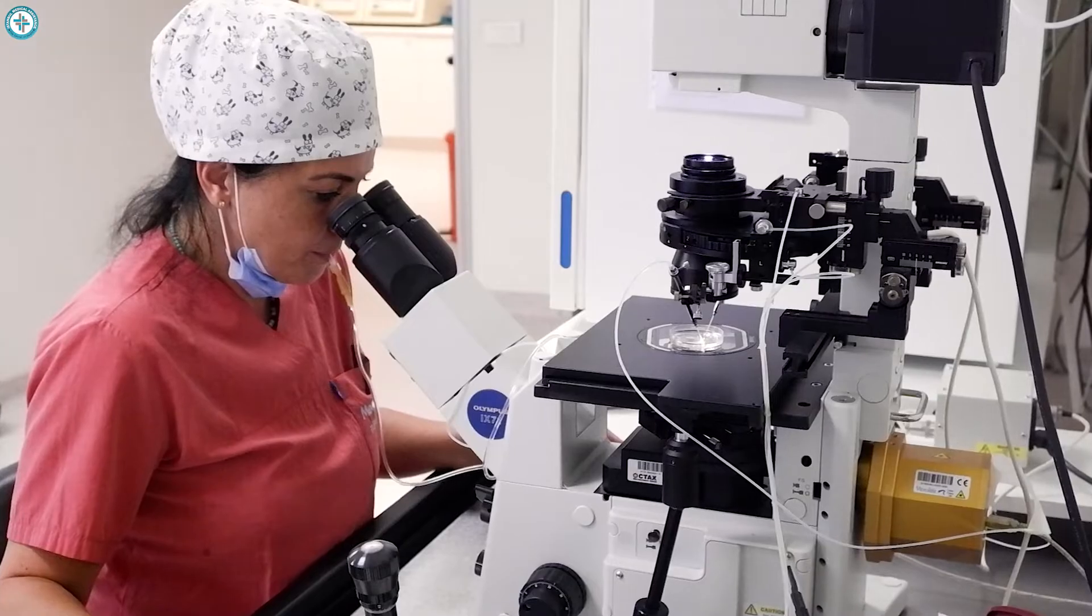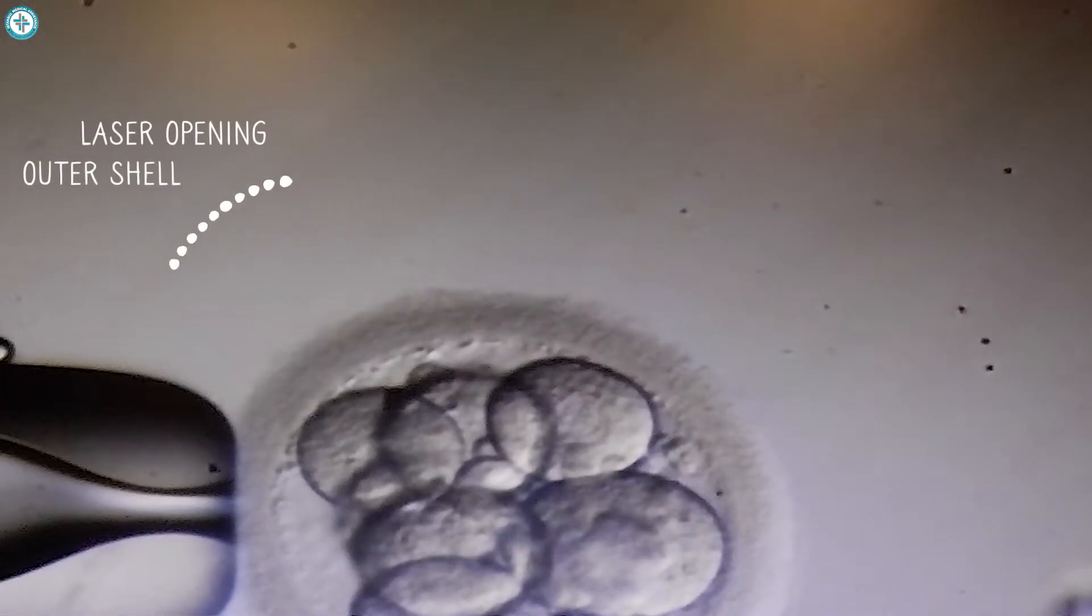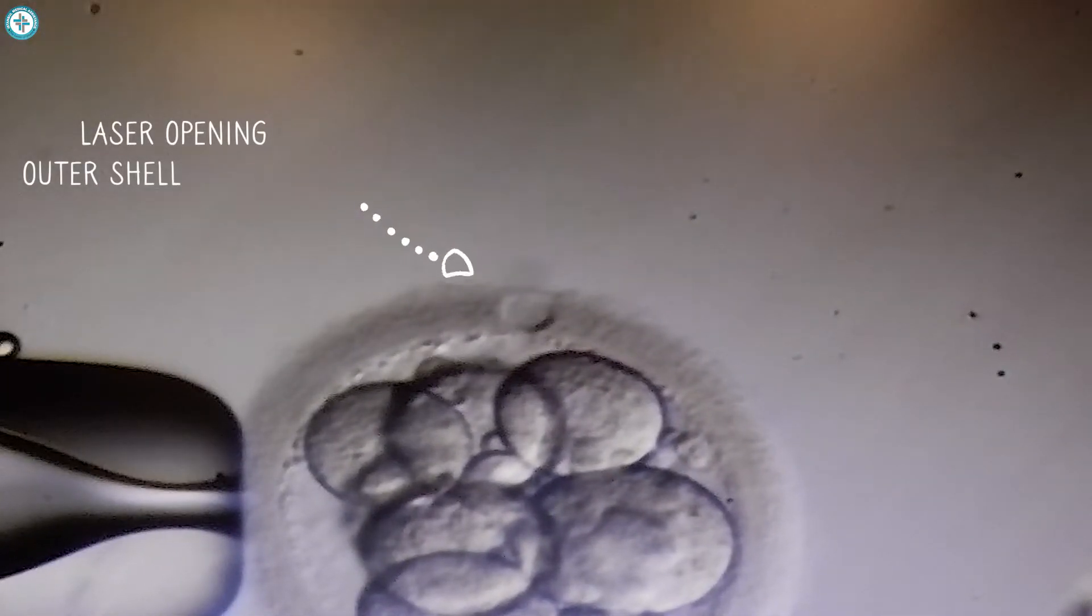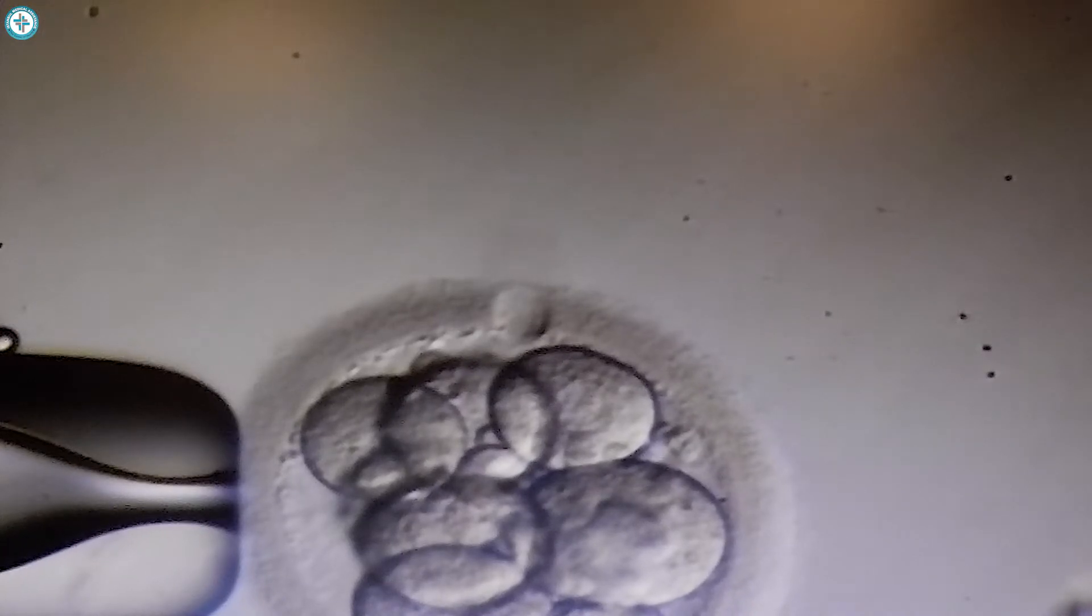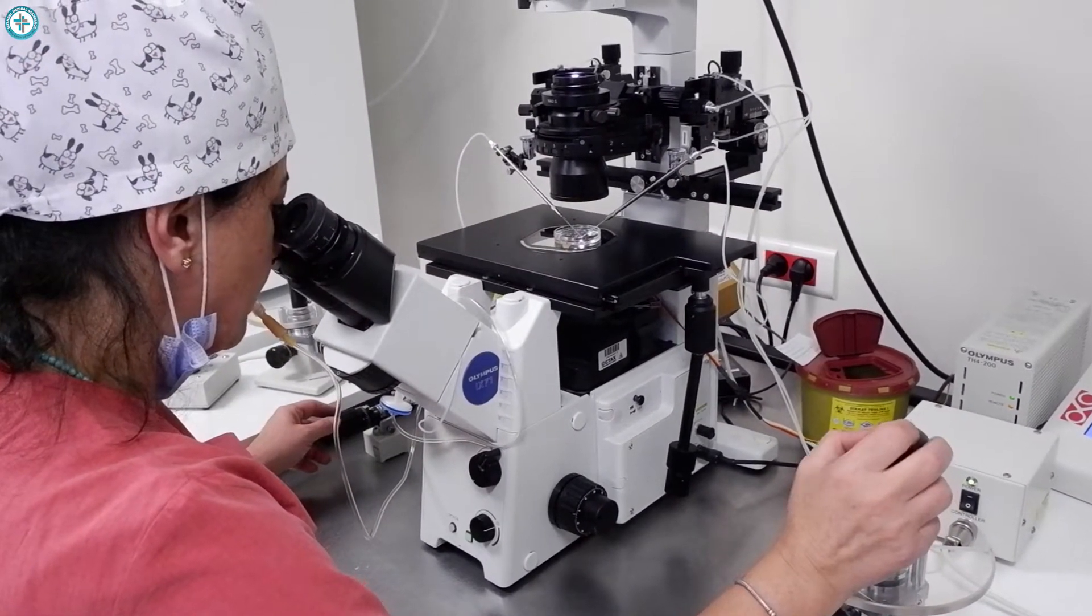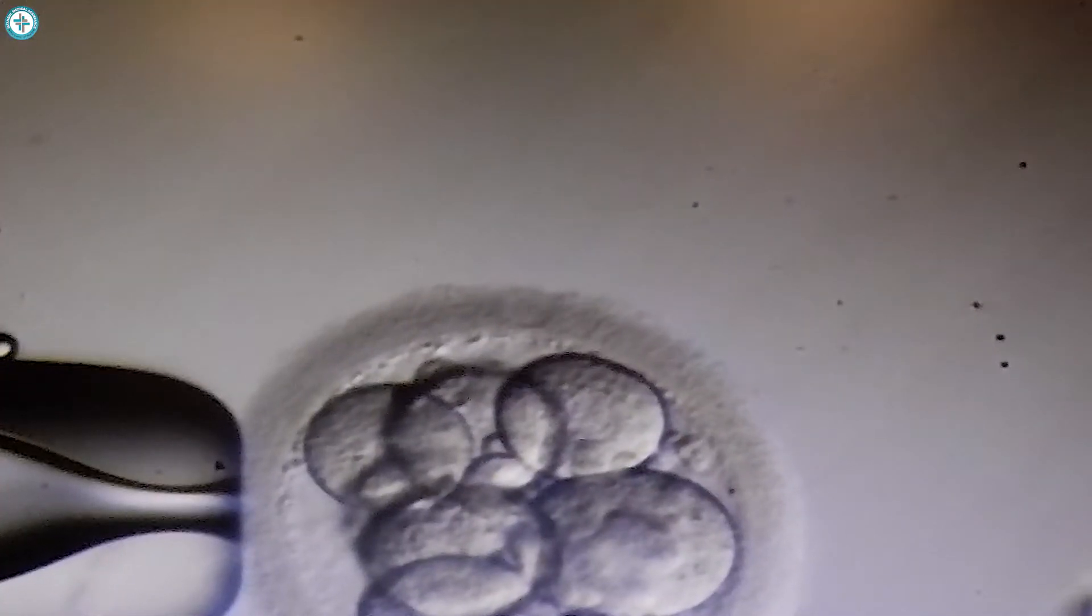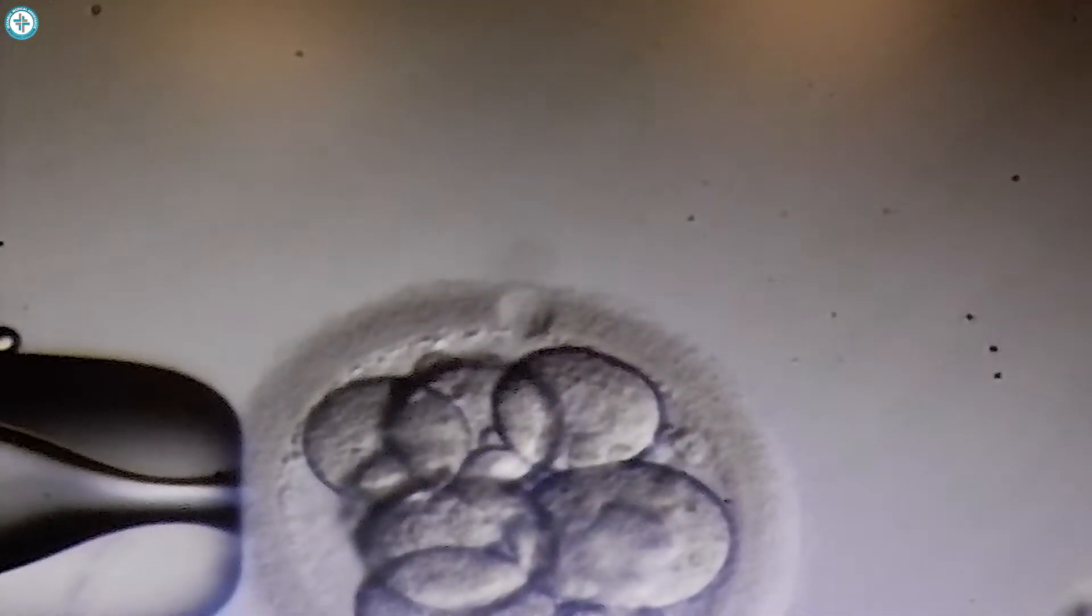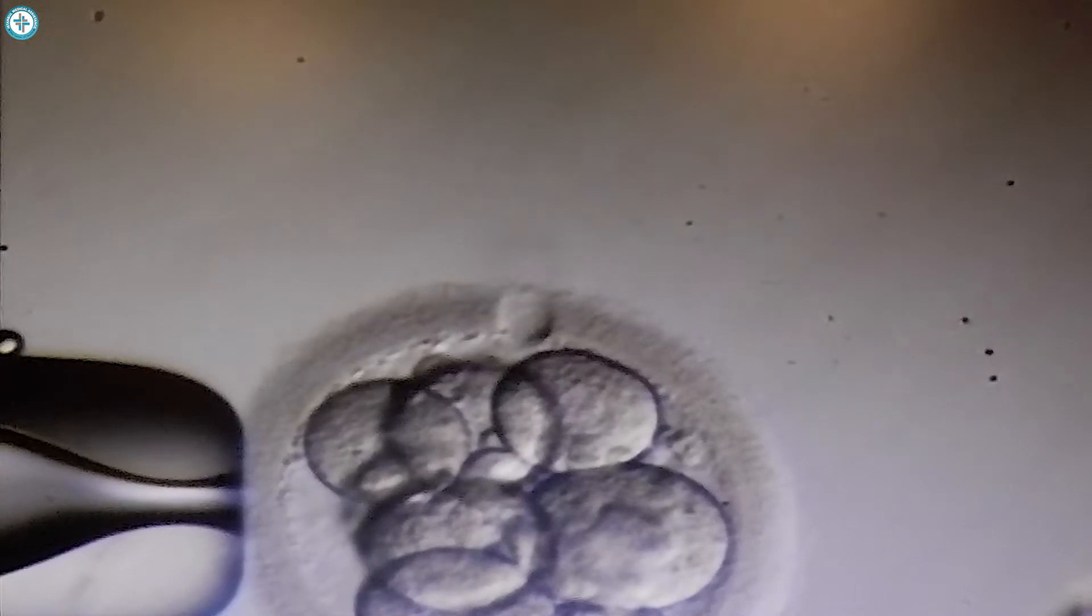For laser assisted hatching, she uses a laser device to make an extremely precise opening on the outer shell of the embryo. The goal of this procedure is to aid the process of embryo hatching and increase the chance of implantation.